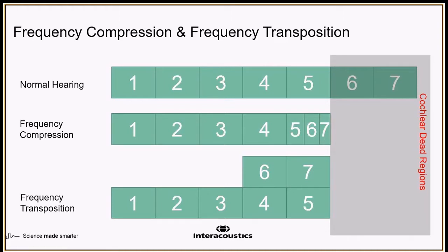Finally, more modern solutions that we're seeing today are actually maintaining the stimulation of the sound in this area of inaudibility or area of cell death. Now you may look at that and think, well, why would you do that? If they can't hear there anyway, then why amplify in this area that they're probably getting no benefit from? And actually there is benefit to this, and it's typically for the higher harmonics that this causes. So resonations at higher areas of the frequency bandwidth in their audiogram, which contribute to naturalness of sound. By having these harmonics or having these multiplications of this sound, it allows them to get a more natural sound out of what they're hearing. This is just a summary of how this feature is working. But how do we verify it?